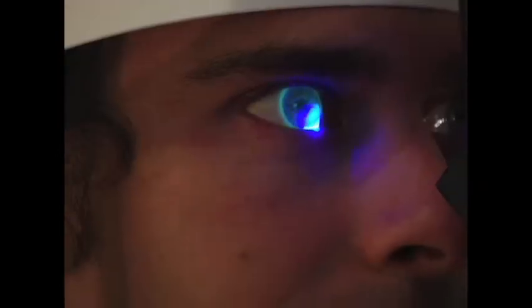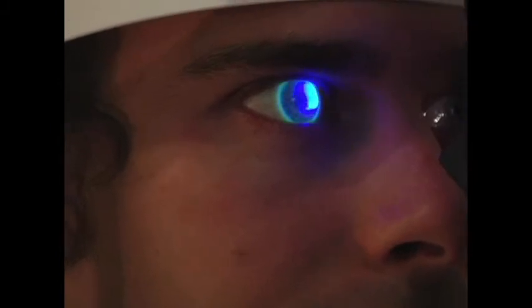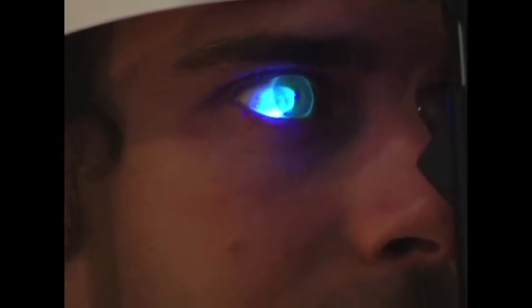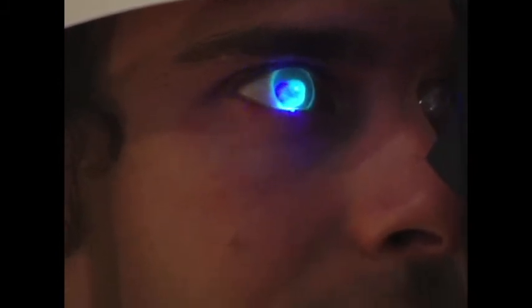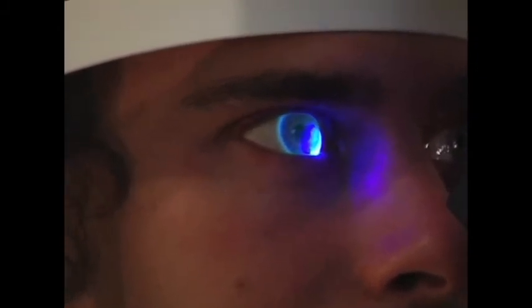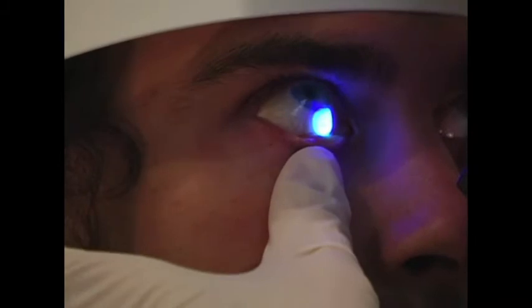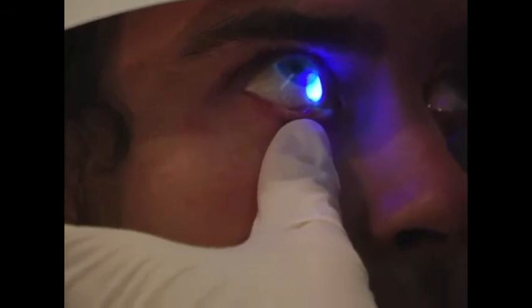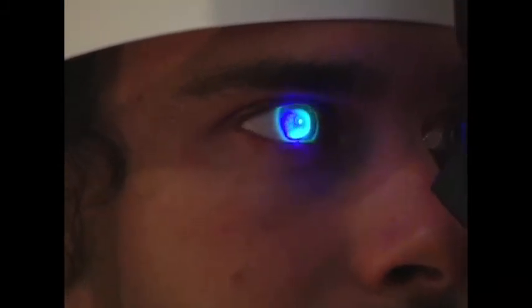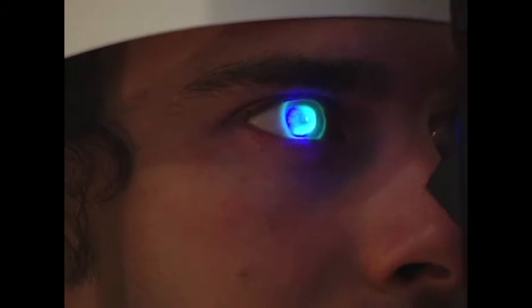After applying fluorescein, turn the upper knob until the cobalt blue light is on. Corneal epithelial defects will stain green with fluorescein when viewed with the blue filter. If you see fluorescein uptake on the surface of the cornea, ask the patient to blink to make sure this is truly a lesion and not just a mucus strand or chance collection of dye, known as pooling of dye.